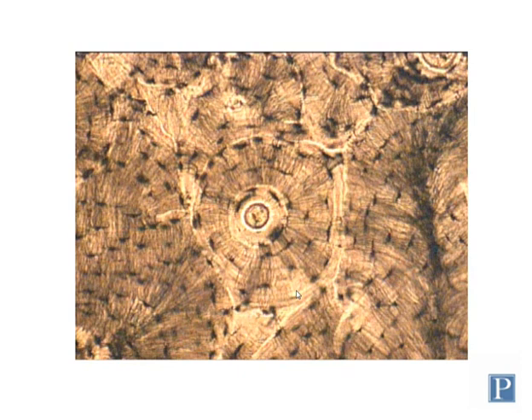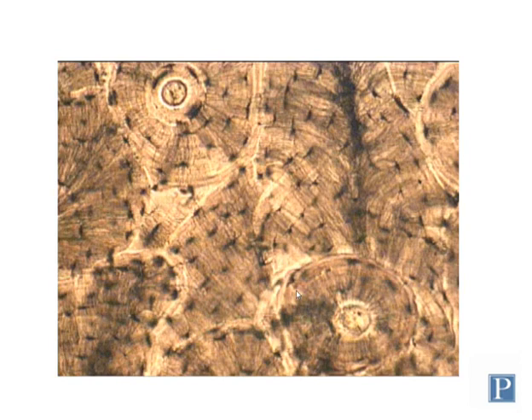The third type of lamella, besides circumferential lamellae and concentric lamellae, are called interstitial lamellae. Interstitial lamellae are irregular shaped lamellae in between the concentric lamellae. So here we can see lots of interstitial lamellae. Notice that they're not circular shaped.